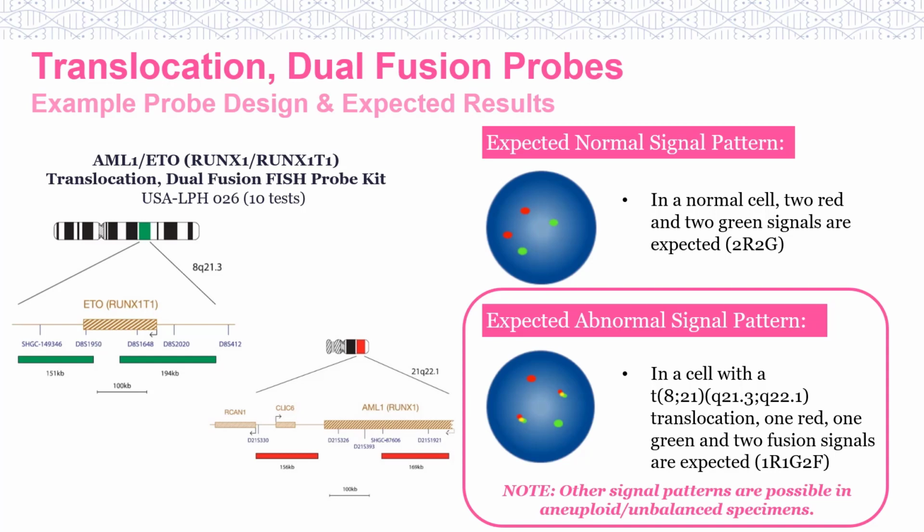In addition to the reciprocal translocation 8;21 creating this typical signal pattern, variant translocations have also been reported for these genes, which could be cryptic and easily overlooked by G-banding. It is important to know variant translocation signal patterns are possible, as well as aneuploid signal patterns, and each laboratory should have their own established cutoffs for these potential patterns during the probe validation process.